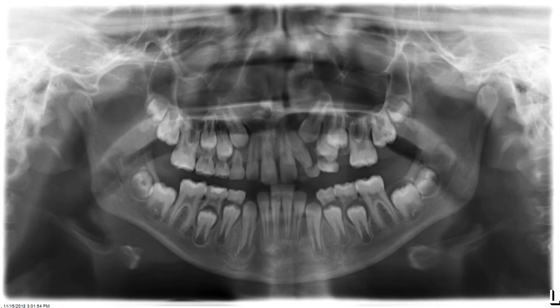Hello everyone. Let's take a look at this 9-year-old patient that presented to our clinic for orthodontic treatment. Keep in mind this patient is 9 years of age.